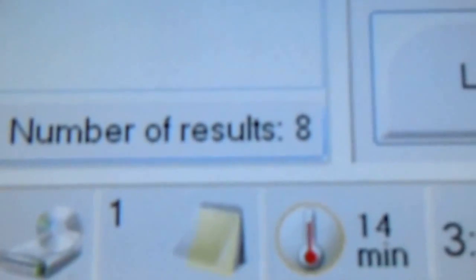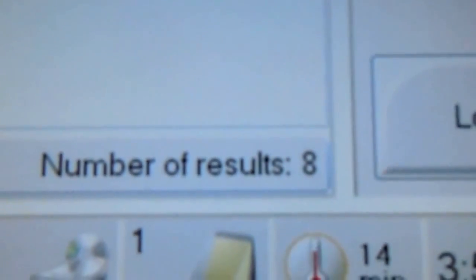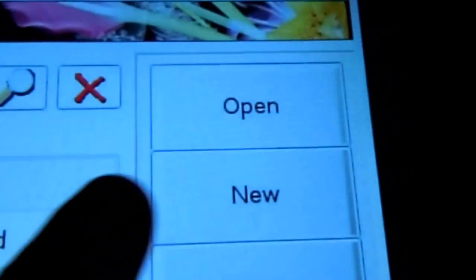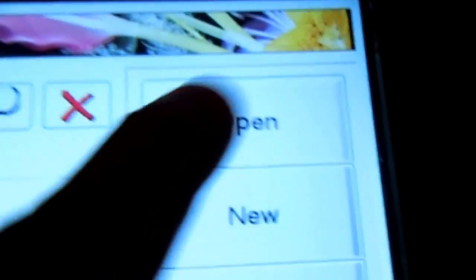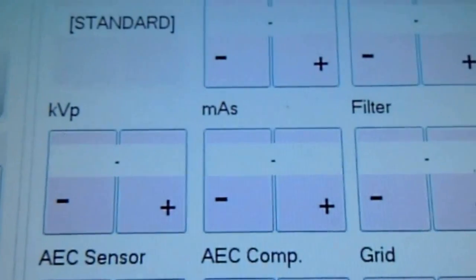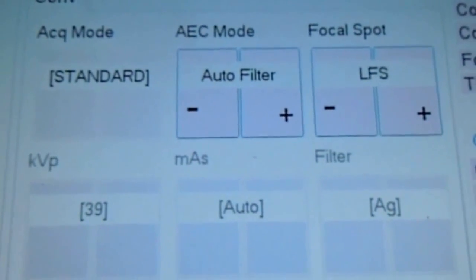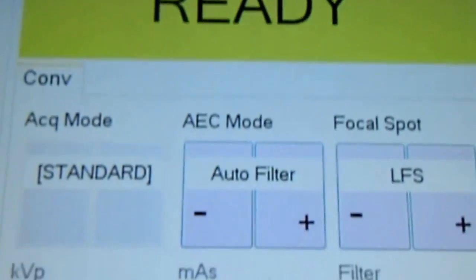Right now the tube is warming up. We have 14 minutes. So we're going to select biomed and open. And it says ready.